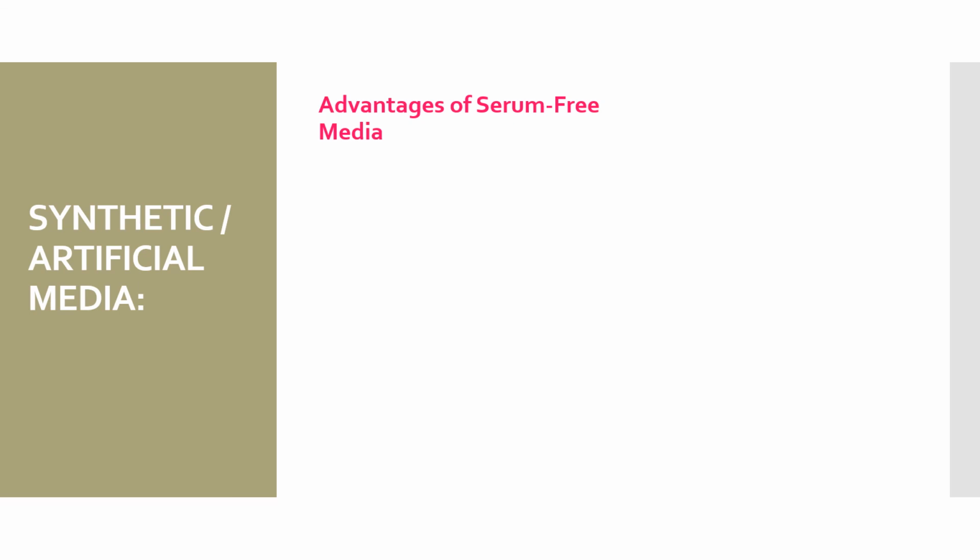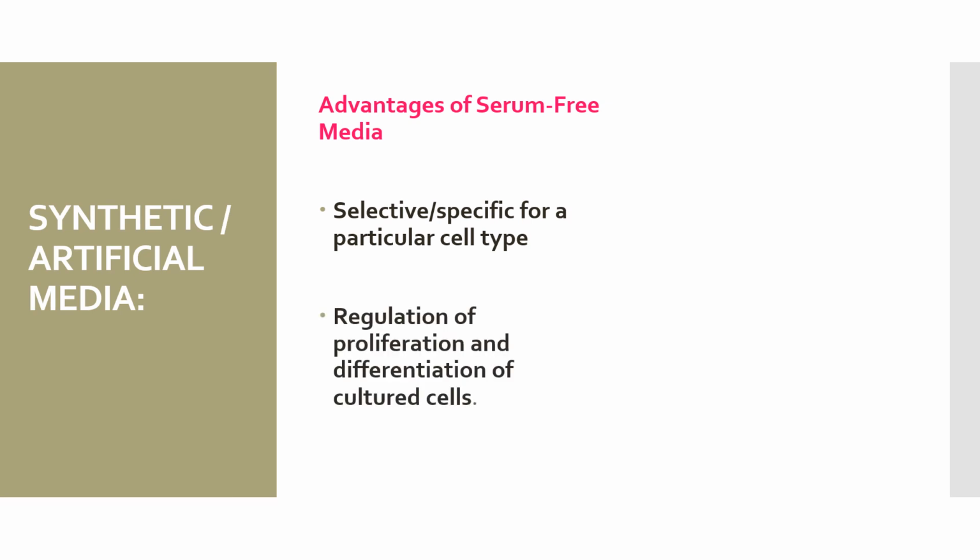The advantages of using serum-free media are the selectivity or specificity of a particular cell type, and the ability to regulate the proliferation and differentiation of cultured cells. The disadvantages of using serum-free media are the multiplicity, that is, each cell type appears to have different requirements.